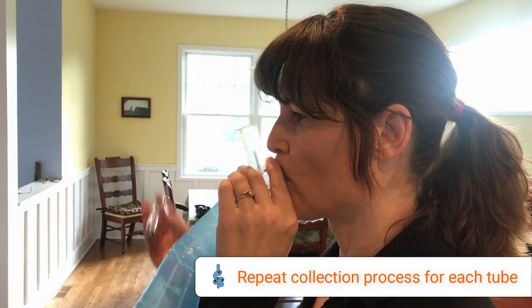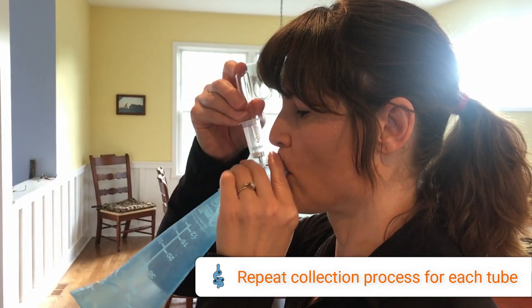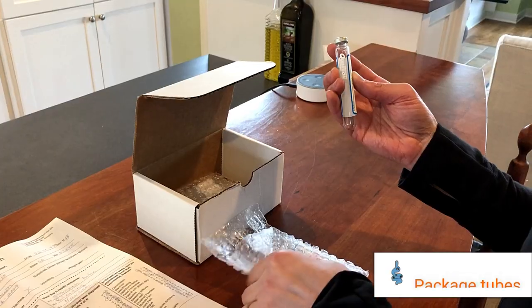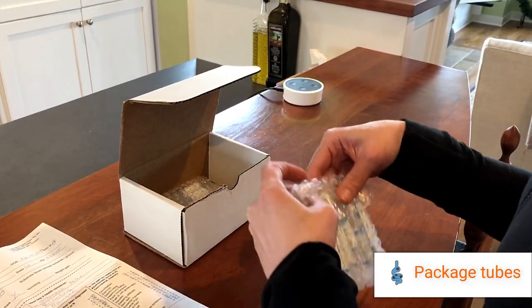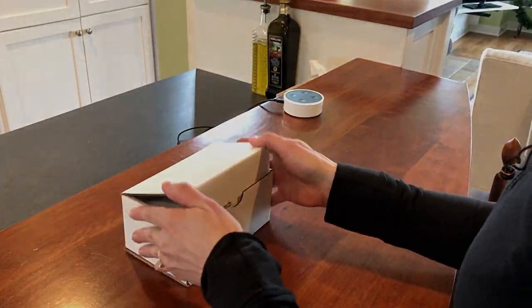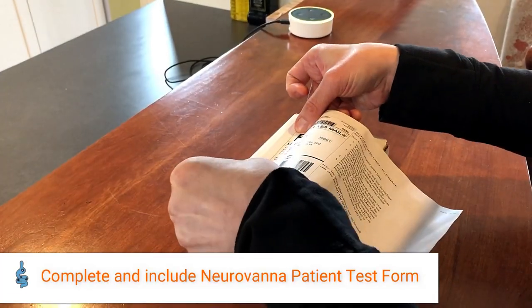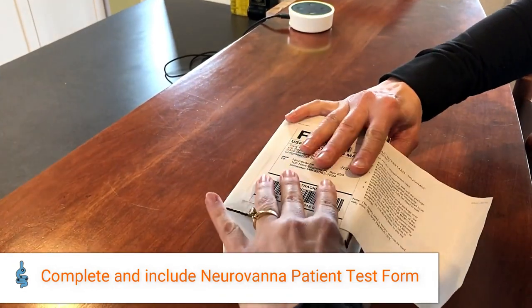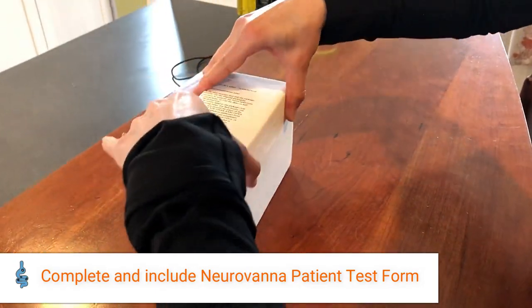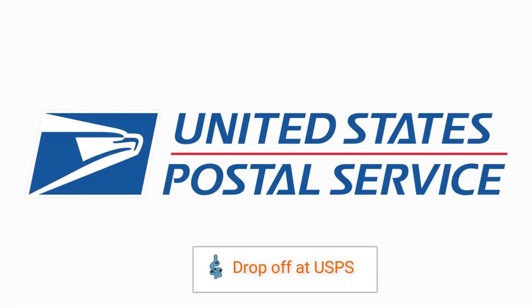Repeat the collection process every 20 minutes until all tubes are collected. Upon completion of the test, protect the collection tubes by putting them in bubble wrap envelopes. Place the protected tubes and your completed patient form back into the collection box and close the box with the shipping label.